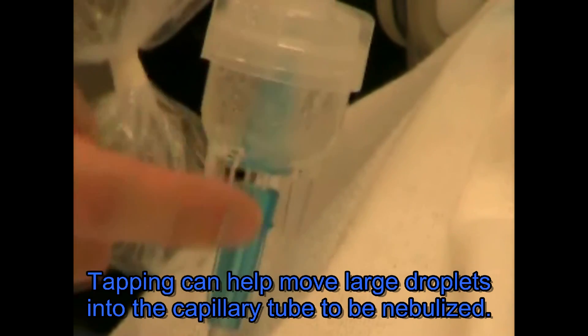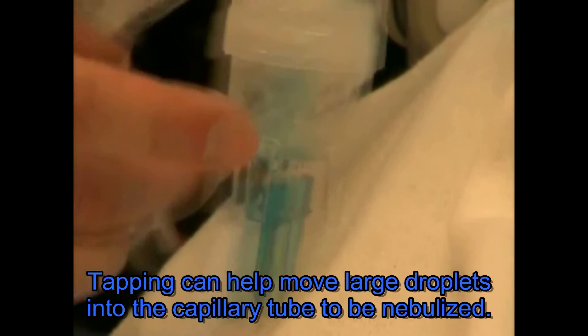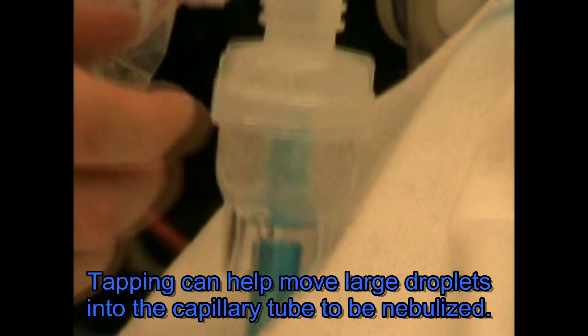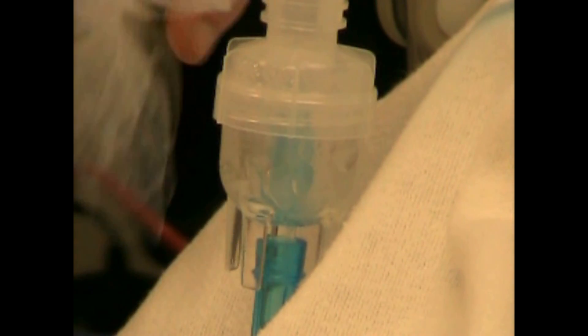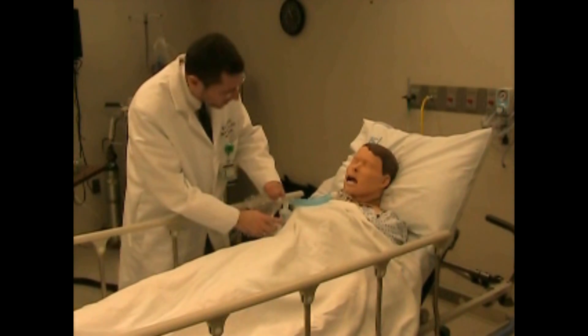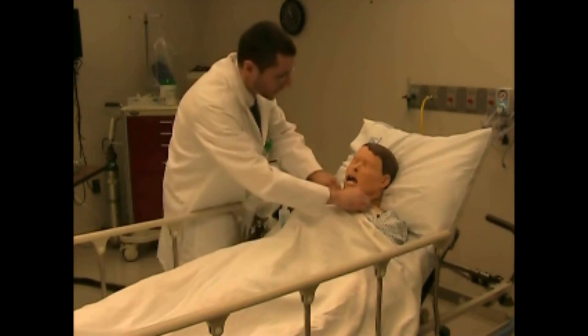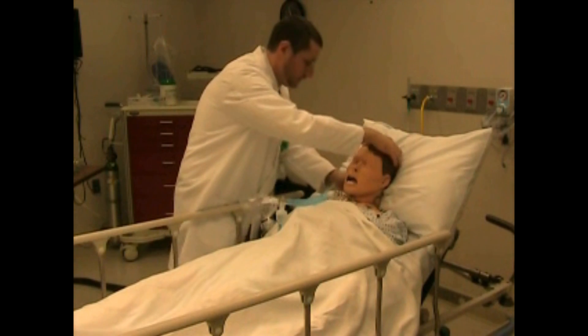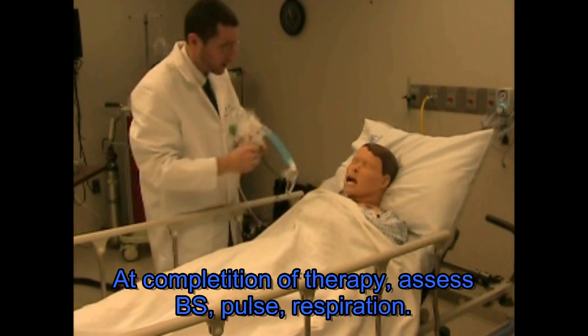Therapy continues until the medication is completely nebulized — you will note that with what's called the sputtering of the aerosol. Tapping will help move particles that are adhered to the side walls and bring them down. Okay, so it looks like your treatment is just about finished. I'm going to shut your oxygen off and take that trach mask off. We're all finished and we'll see you again in about four hours.